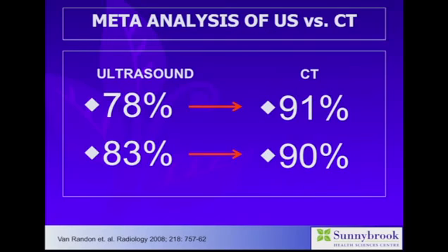One of the biggest criticisms of ultrasound in the setting of appendicitis has been non-visualization of the appendix. The rate of visualization of the normal appendix on ultrasound is varied in the literature and ranges from as low as 2 to 3% to a high of 82%, and this is in a paper from France in 1992. In my own experience, the more you work at it, the more you are able to find the normal appendix, and I certainly hope that we achieve this more often than 4%. I'm not sure that we're reaching a rate of 82%.